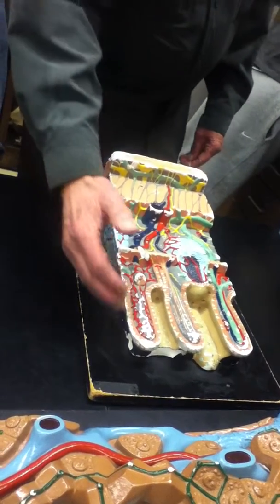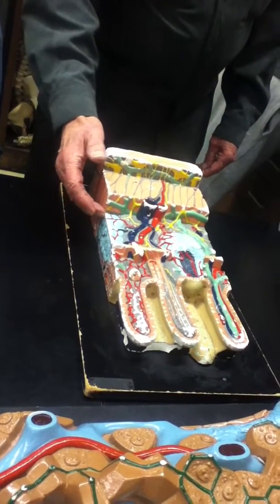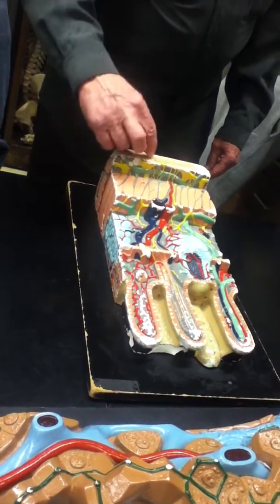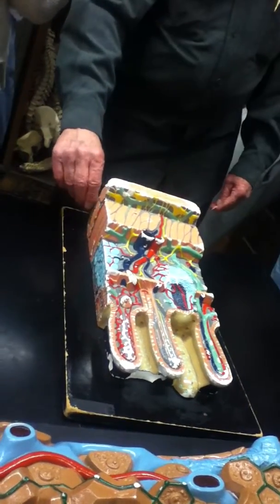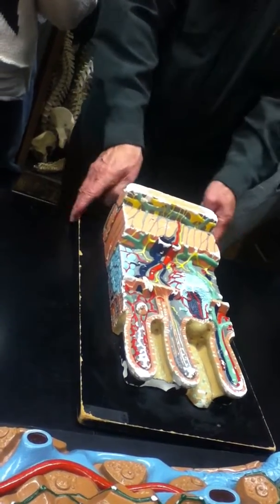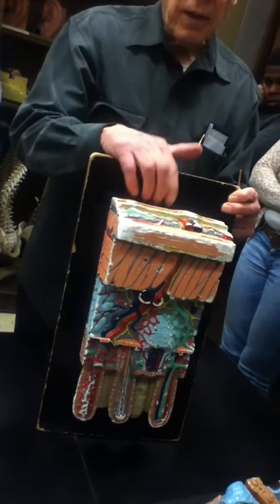From here up, we have mucosa. Here are muscles, so this is muscularis, and this thin serosal layer over here. You can see the flattened squamous epithelial cells making up the serous membrane right there.